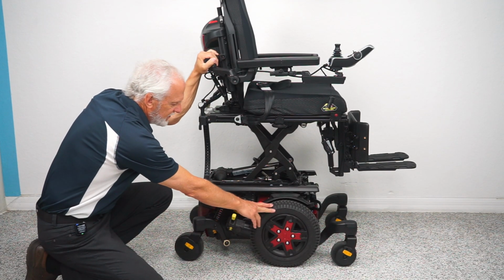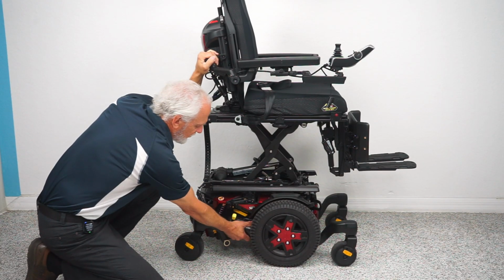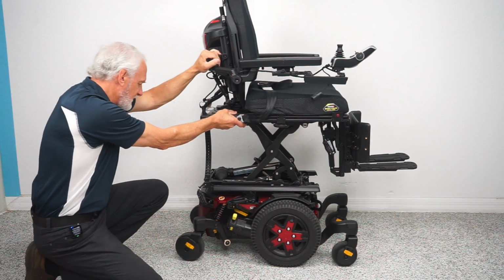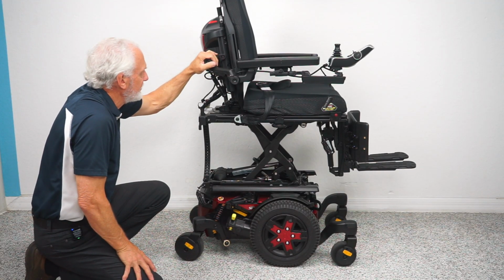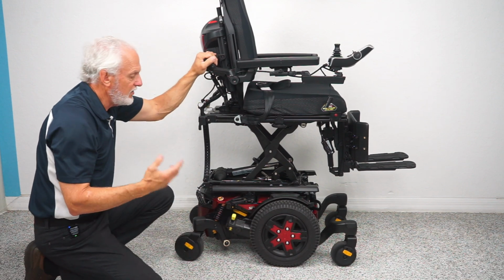The wheel is 14 inches, and they're not going to mark your floor. They're non-marking wheels. You have a motor right here for each wheel. This motor is for this side. There's the same thing on the opposite side. If I want to push this chair, well, look, it's not going anywhere because it weighs 416 pounds and it's in gear. But if you ever have to push it, say 5-7 years from now, you have an issue.